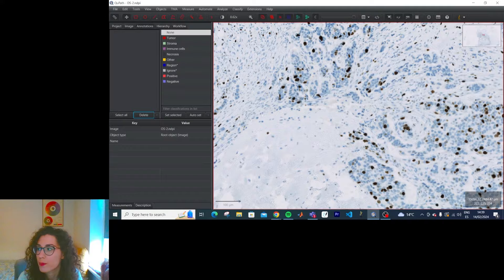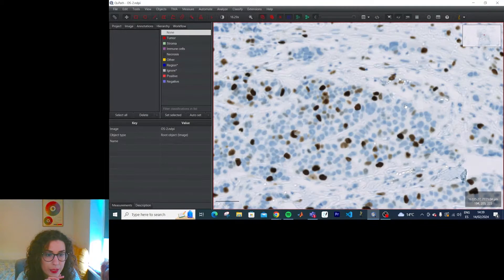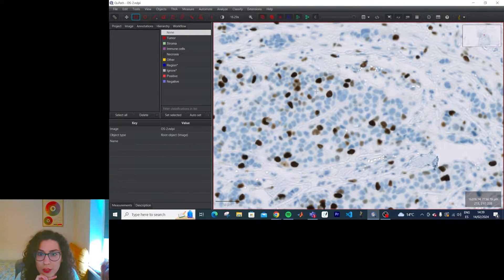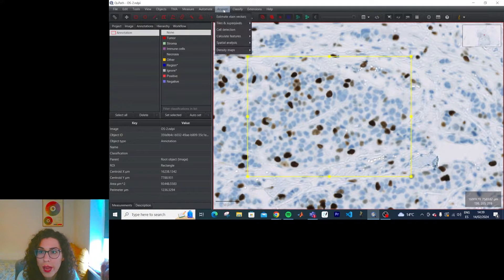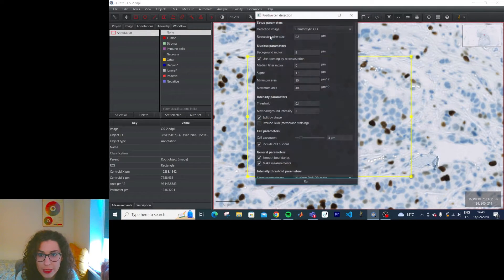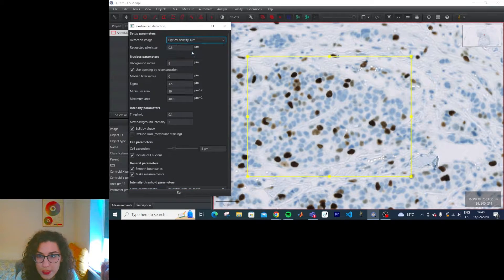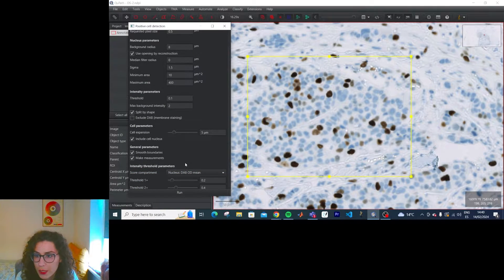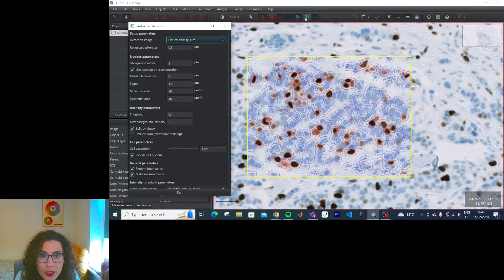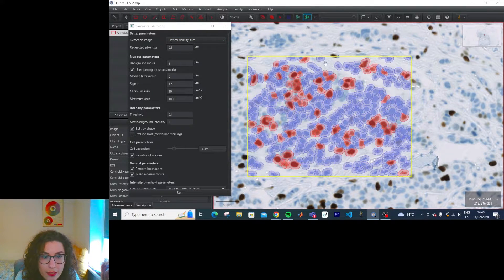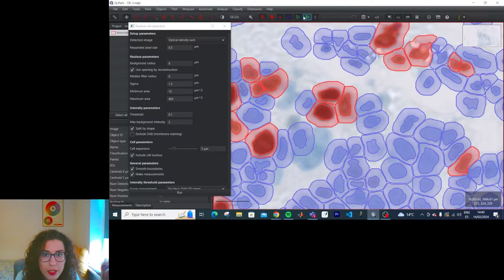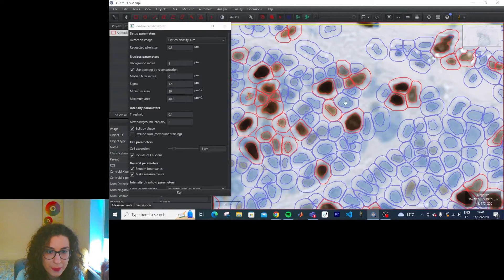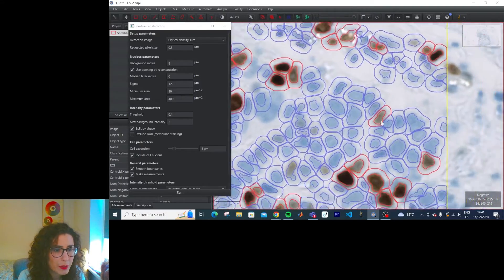So the idea is the same. Pick a small-ish area. Create an annotation. Analyze cell detection. Positive cell detection. And do optical density sum. Let's run it as it is for now. And apparently with this you can... There's a difference. You kind of fill in the annotation. Let's look at this. This is better than the previous one.